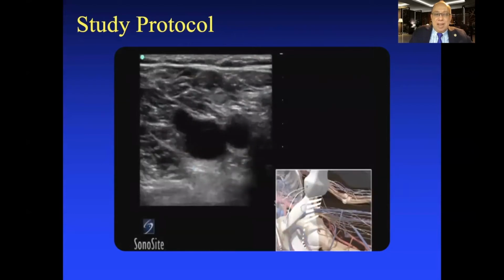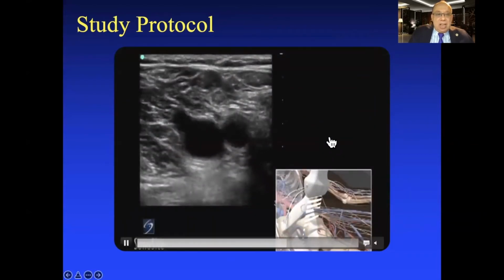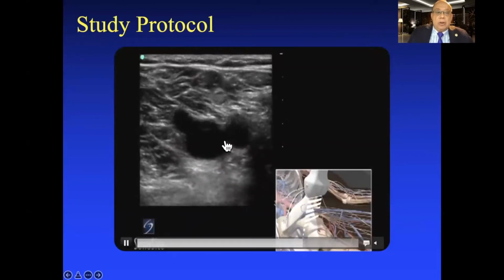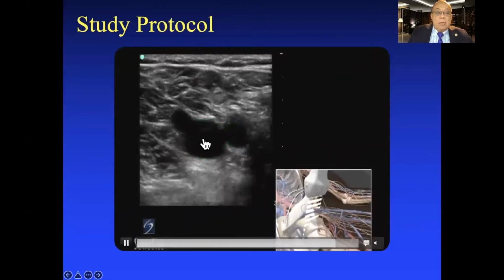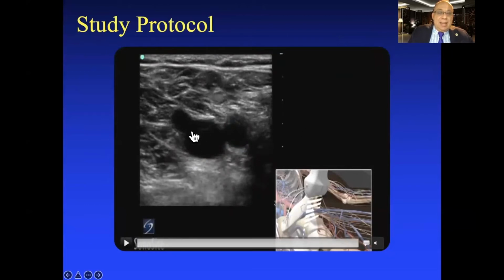And here we can get the vascular elements. I mentioned that we have to recognize the anatomical structures. We have a face and 2 ears. This ear here corresponds to the common femoral artery, here the common femoral vein, and here the confluence, the saphenous femoral confluence. We have to look for the interior of these structures.